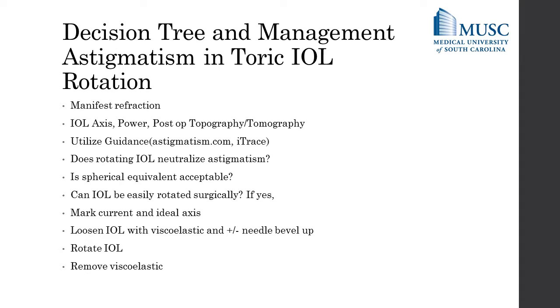You have to ask some questions: will rotating the IOL neutralize your astigmatism, is the spherical equivalent okay, and can you rotate this lens? If you answer yes to these questions, then you mark, do the first pearl, viscodilation, rotate your lens, and of course, remove your visco.